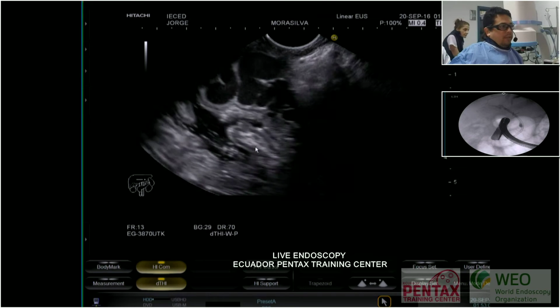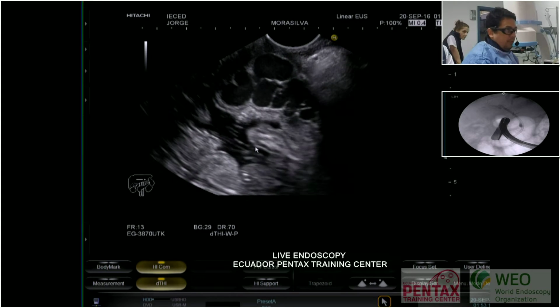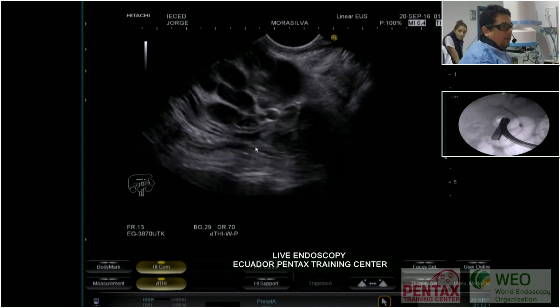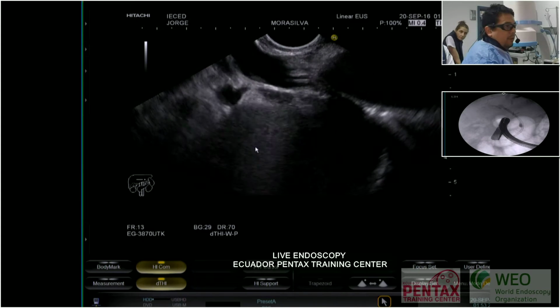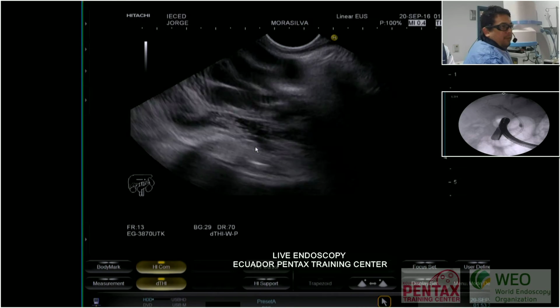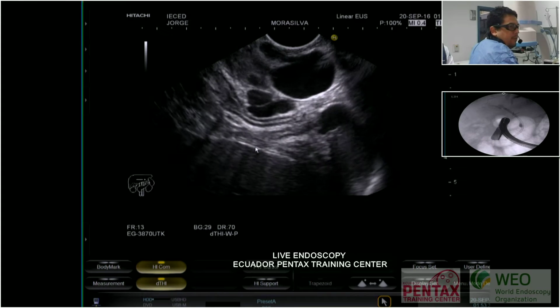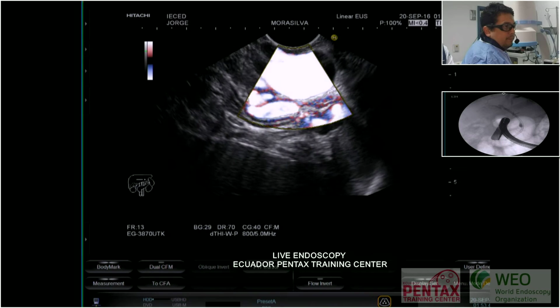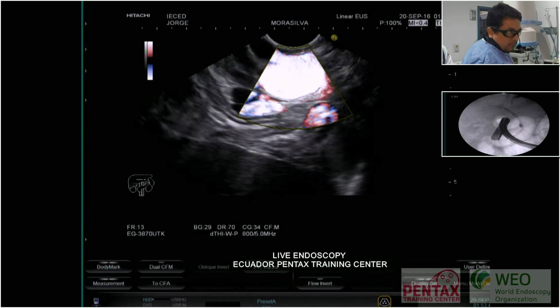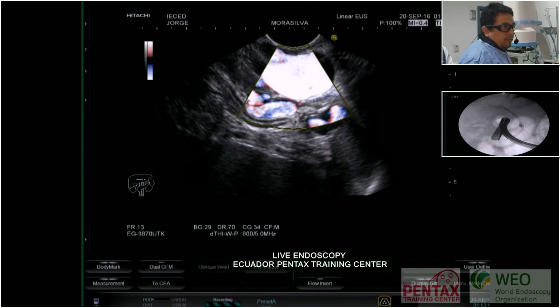In our unit, we also use angiography injection to determine exactly if we are in a good position to avoid any kind of complication. The other important thing is to see where the feeding vessel of this varice is. I think this is the feeding vessel here, so we will check with Doppler. This is the area where we need to put our needle. I will try to explain each step to perform this procedure.